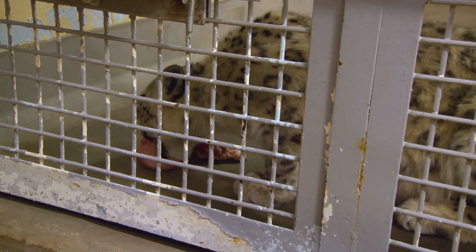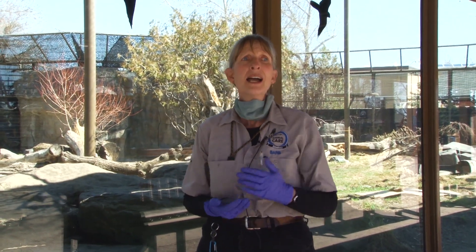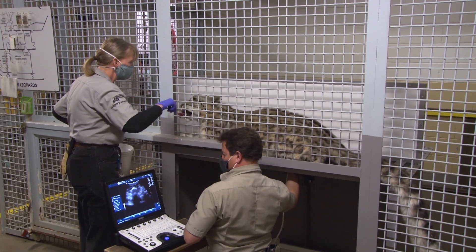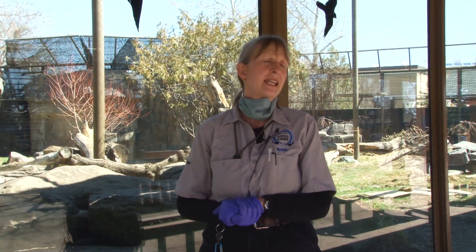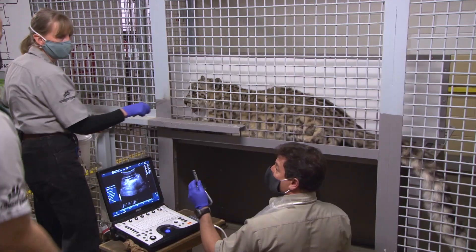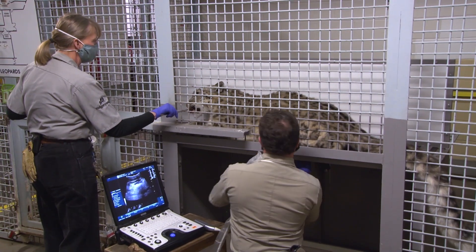What you're going to see in this video is all of us decked out in PPE. As you may have heard with the COVID-19 pandemic, cats can be prone to COVID-19, which is really unfortunate. So we will wear masks anywhere around a cat now — for food prep, cleaning, or anywhere in the same space as a cat, everybody gets decked out in PPE. Even our camera person today was decked out in PPE with a really thick mask to make sure we don't spread anything we could potentially have to a cat.